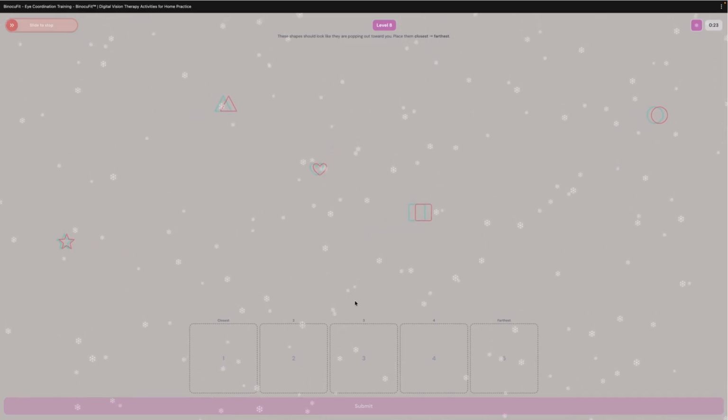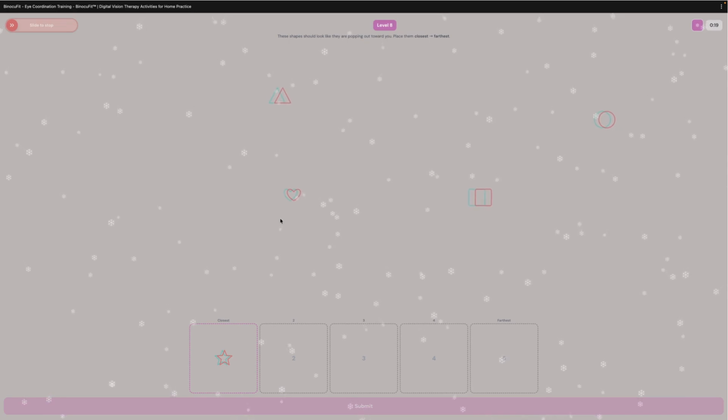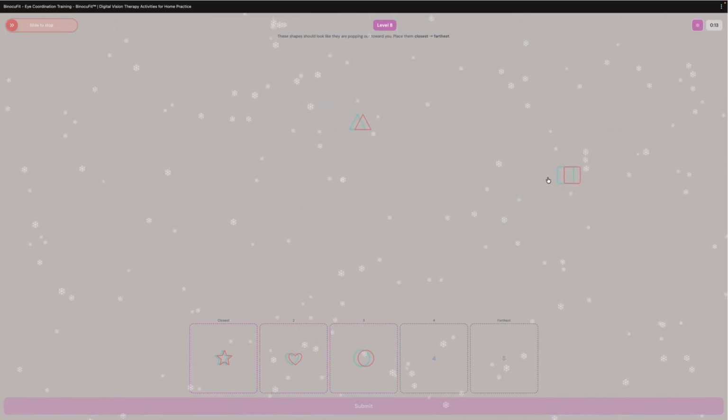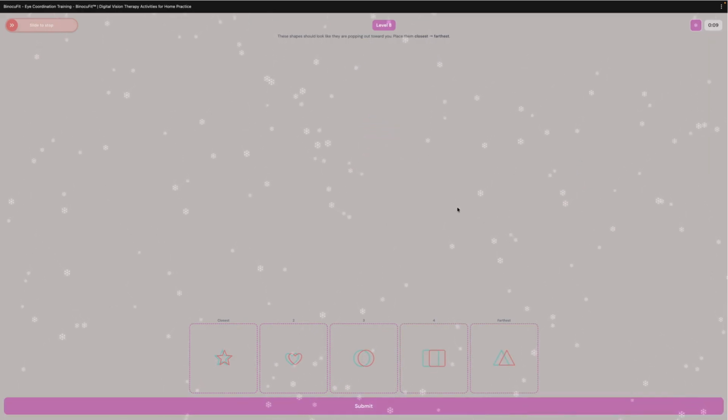So on that beginning settings screen, remember that you could have these objects still. And they don't need to be moving around on the screen, but that movement was a suggestion of one of the early users. Somebody demoing the activity suggested it, so we added it.